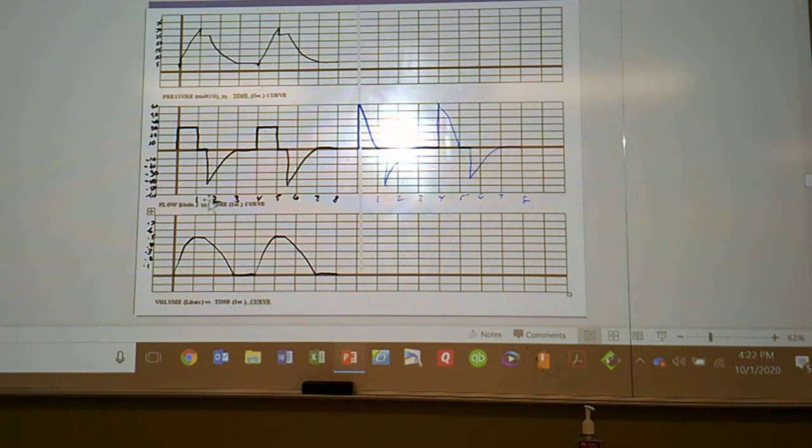So we went to 60, and then what did we do from there? The ramp came back down and ended at 0. There's a small pause then, the plateau, so there was 0 flow. And then I have my expiratory portion. So our plateau was 25.